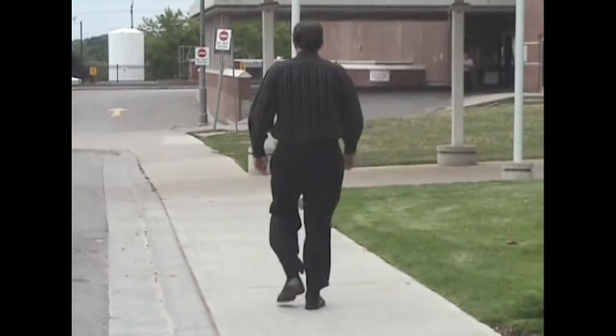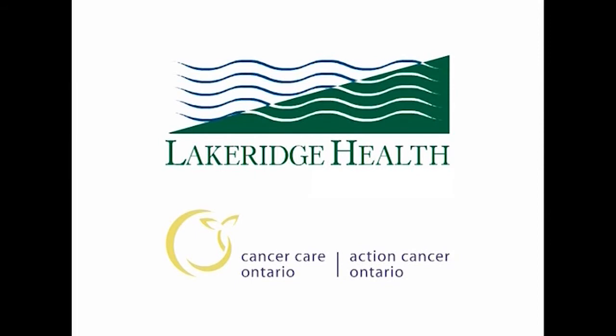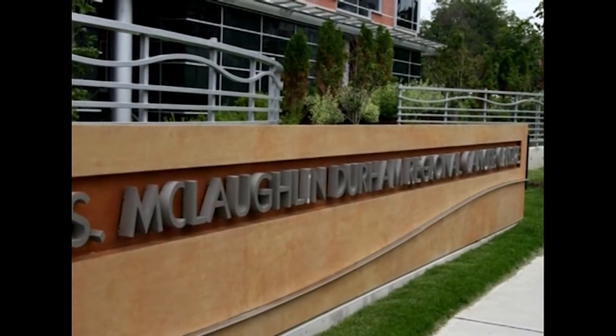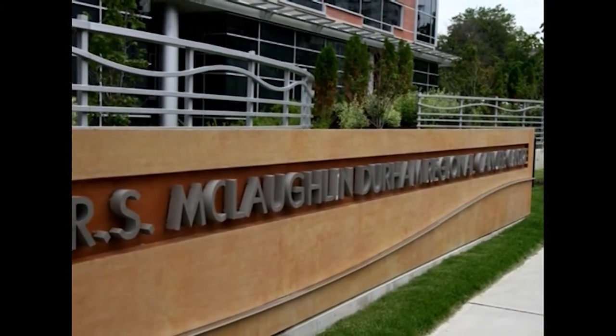We hope we have made you feel more comfortable about coming to our cancer center for your radiation therapy treatments. Our caring team is a group of dedicated professionals who are committed to providing health care to the highest standard. If you have any questions concerning radiation therapy or your specific treatment plan, please do not hesitate to contact one of your care providers here at the R.S. McLaughlin Durham Regional Cancer Center.